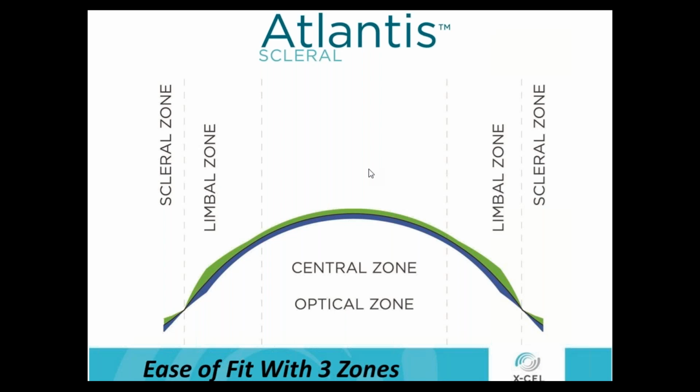Most changes on scleral lenses come from the scleral zone. So meaning if I fit a patient and I'm seeing that patient on a follow-up visit, the changes that are most made are to the scleral zone because of the settling process. Every scleral lens settles. So that settling process can be a little bit unpredictable. And then we have to change the edge.